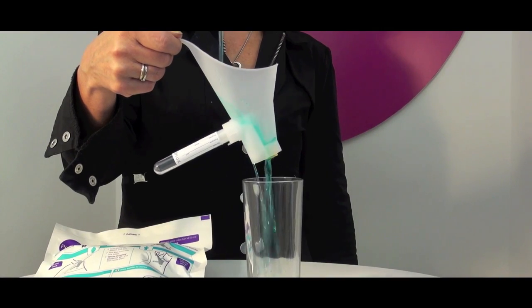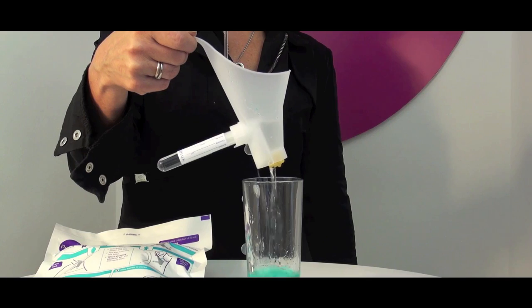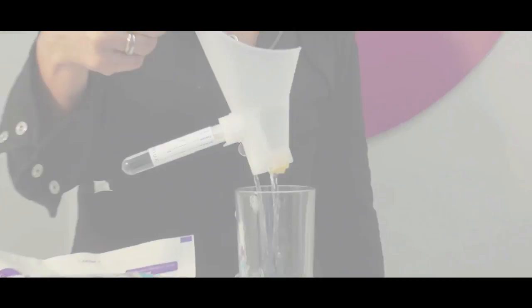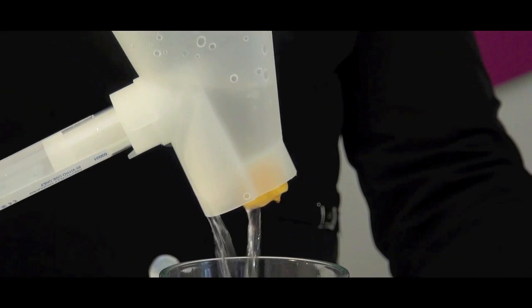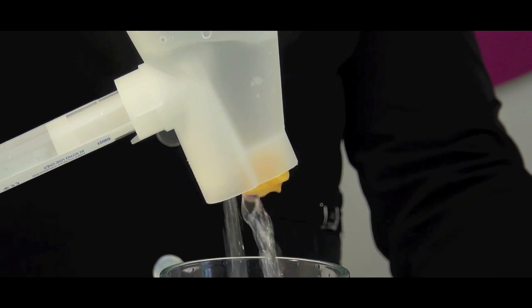The first flush of urine, here represented by blue fluid, goes straight into the loo. Then a small cellulose sponge expands to block the exit, sending the midstream into the tube. Overflow urine is expelled through a separate duct, which means PZ cannot overflow.